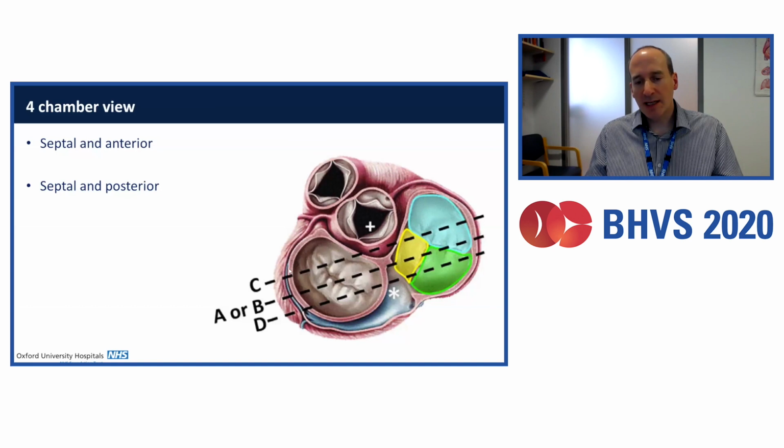From the 4-chamber, again, depending on exactly what level you're scanning through the heart, conventional 4-chamber being the middle line, you can elevate the plane to bring more of the anterior leaflet in, or you can depress the plane to bring more of the posterior leaflet in. So again, there's no fixed view, and to see all 3 leaflets, you've got to take a sequence of views and understand the relationship in a sort of anterior-posterior direction to your imaging plane to know exactly what leaflets you're looking at.